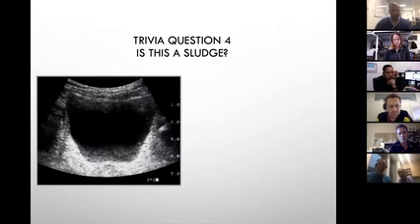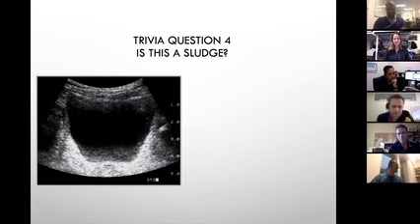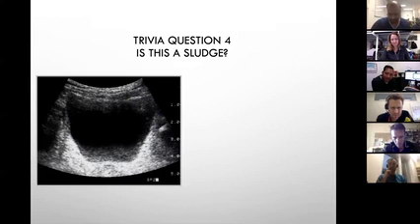So what do you think about this one? This is a sludge. It looks like your gain might be turned up too much in the back. I'm wondering. Very good. Anything else could be possible? If I say the gain's okay, it's just for the argument's sake. Anything else?